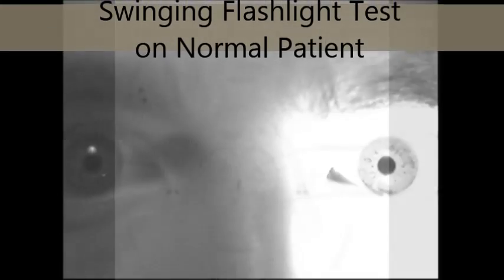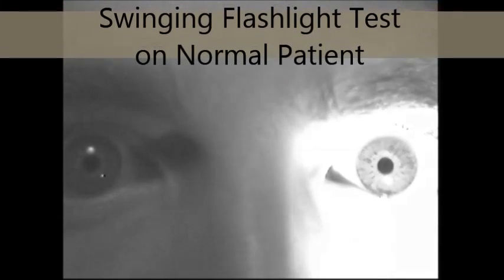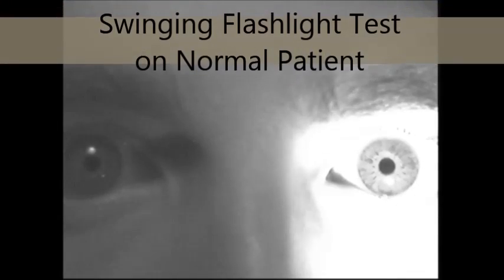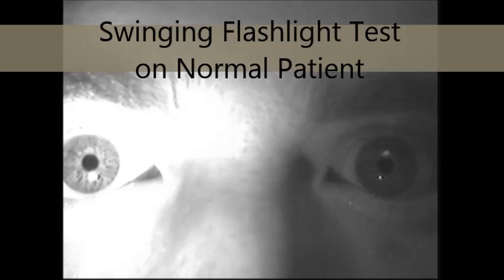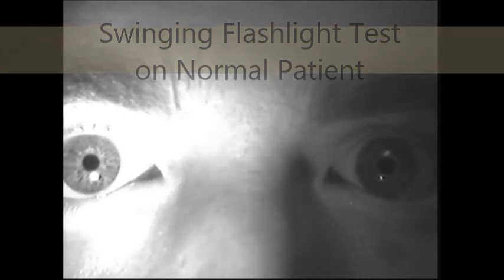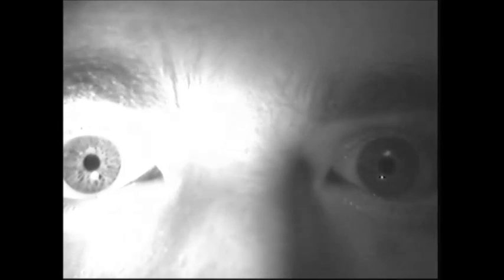This pathway is evaluated using the swinging flashlight test. The patient is asked to fixate on a distance target while the practitioner swings a light from eye to eye several times rhythmically, taking care to illuminate each pupil for an equal length of time, approximately 2 to 3 seconds. This video shows a normal patient with no APD.